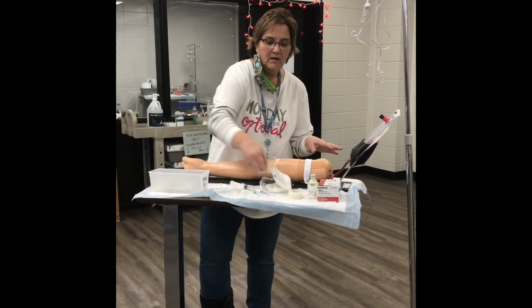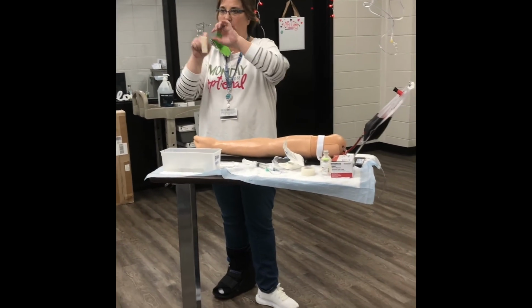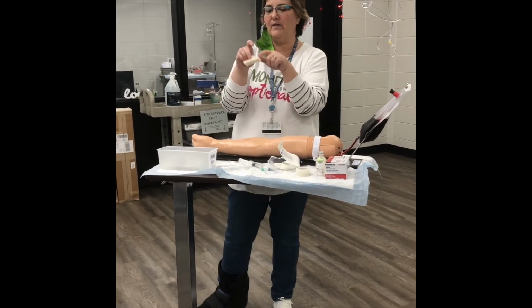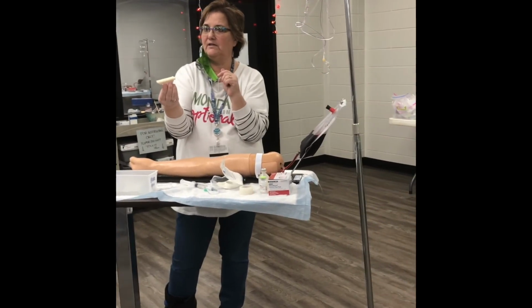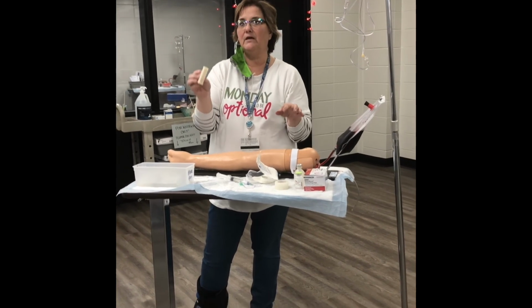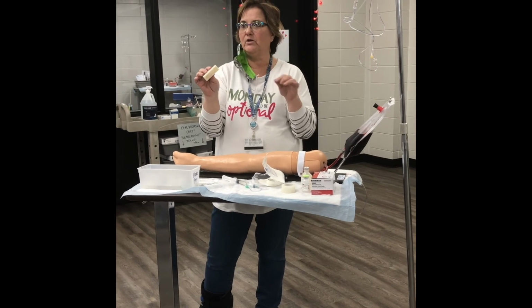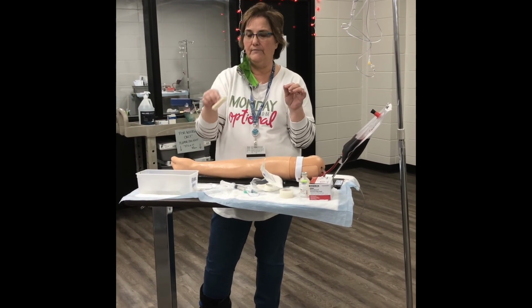Now, the ones in your kits in your bag are just the little ampule, and you have to break it yourself. This is the same thing, it's just in a safety device, so you squeeze it together and it pops on its own and soaks this. So it's ChloraPrep, so remember when I did meds, with alcohol you go in a circle, but with ChloraPrep you do a basket weave, right?